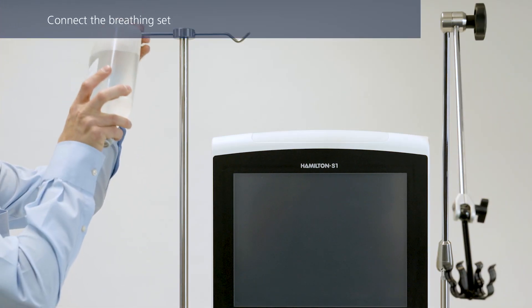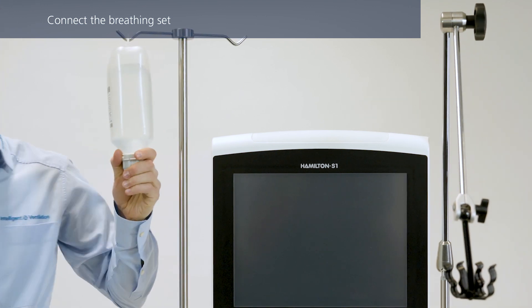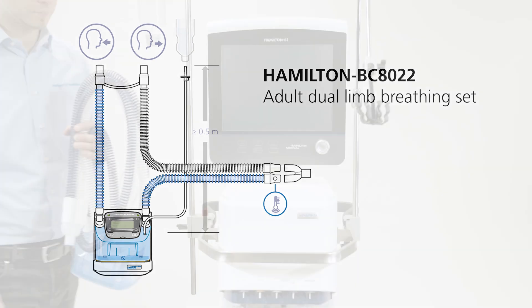Install a water bag or bottle above the humidifier. Choose the correct breathing circuit according to the patient group or selected treatment. The following information applies if you are using the Hamilton BC8022 breathing circuit or any other double limb heated breathing circuit.